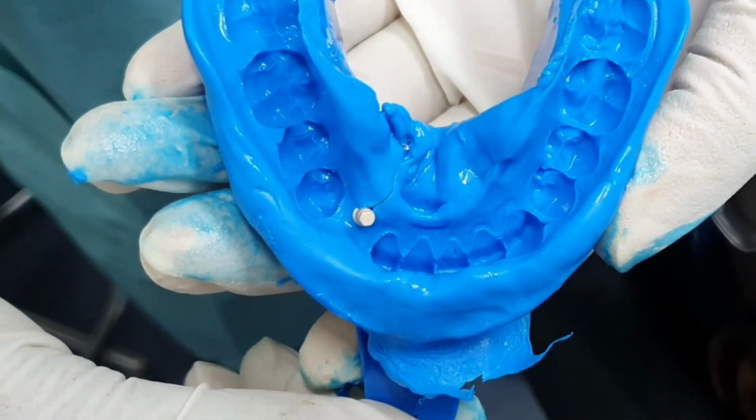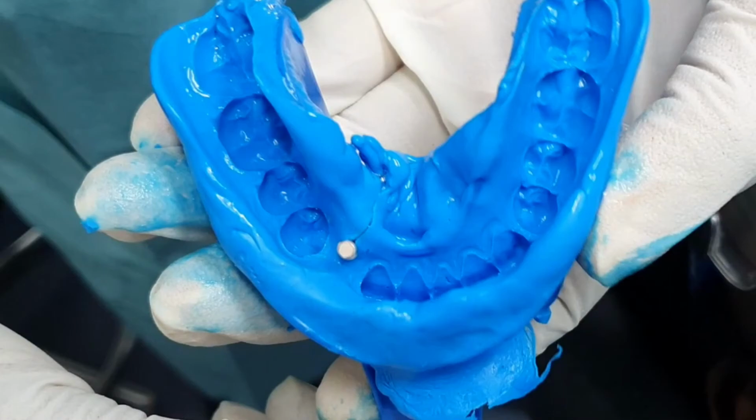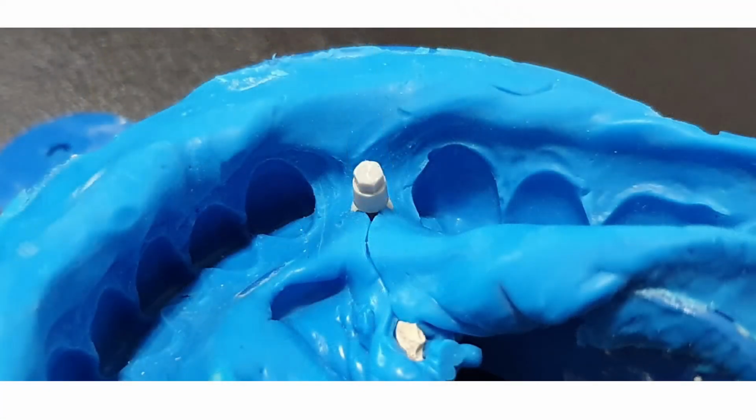Now you can see the impression has now been trapped in there. We've got the detail for the contact points. You do not try to reposition this. Should you take this out and the transfer remain on the tooth, then you have to repeat the procedure. You cannot and should not reposition the transfer in the impression, because that will really result in a very inaccurate situation. This is what you have. You have the transfer, you have the taper. Then this taper would have allowed you to push it through the gum quite easily.